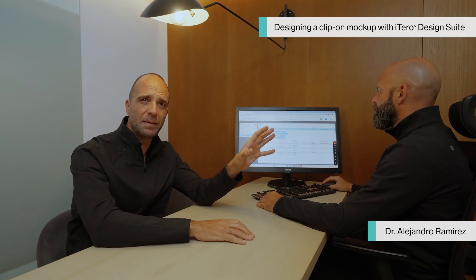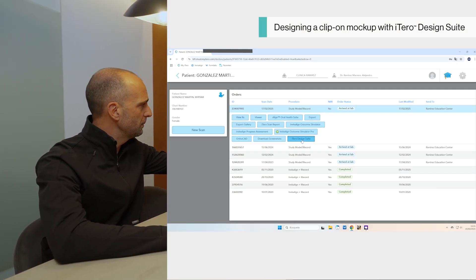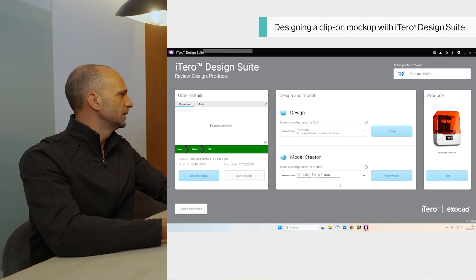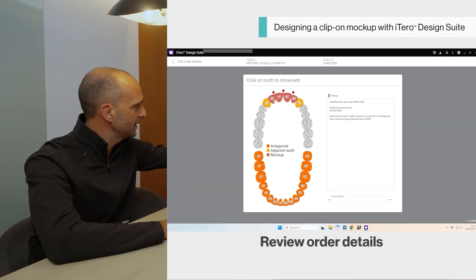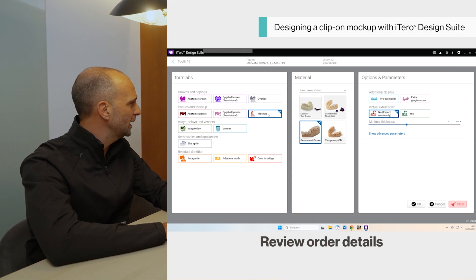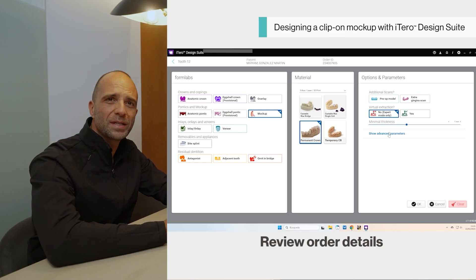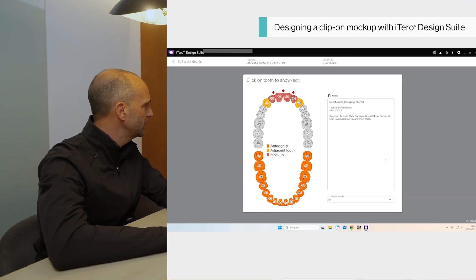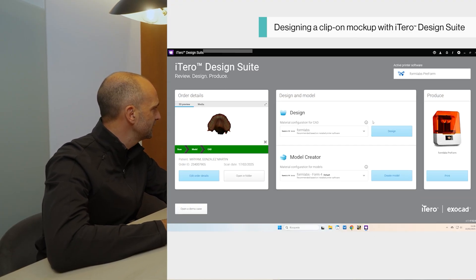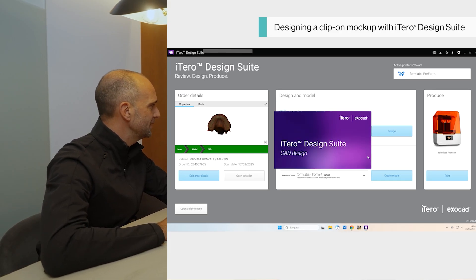First, we will go step by step through the clip-on mock-up phase and design with iTero Design Suite. We will click on the patient's profile — iTero Design Suite will log in and check in. We will review our order details; we have selected from lateral to lateral to do the mock-up, with the material and parameters already preset in iTero Design Suite to be connected to our printer. Now that everything is ready, we can start the designing phase.